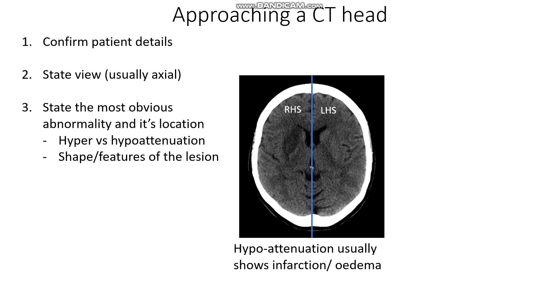Infarcted tissue tends to swell up, leading to edema. Edematous tissue pressing on nearby structures may cause squishing or effacement of certain structures, such as the ventricles here. We can see that if we compare the right anterior horn of the right ventricle, it's a lot more squished than the left-hand side. As well as this, we are not able to differentiate different types of tissue due to the fact that they have infarcted and swollen up, leading to a phenomenon known as loss of grey-white differentiation.